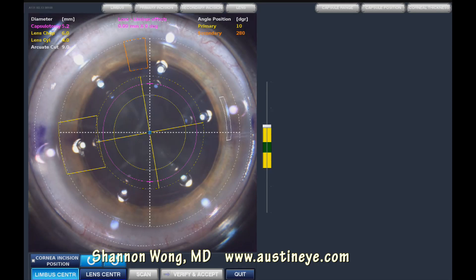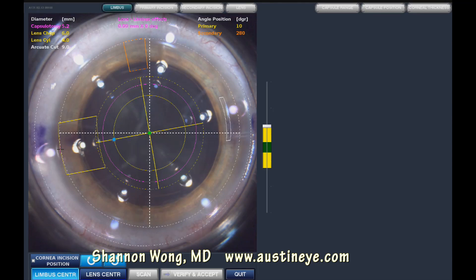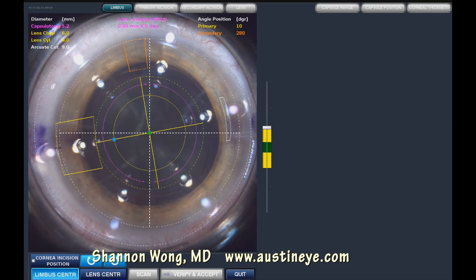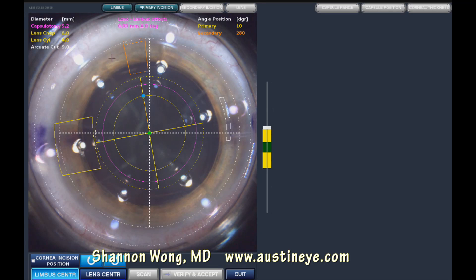Her refractive error is approximately plus 3.75 and this is a visually significant cataract. Because she's had prior RK, we're going to do laser cataract surgery combined with use of the CrystalLens AO.